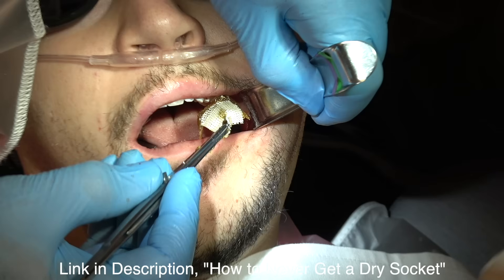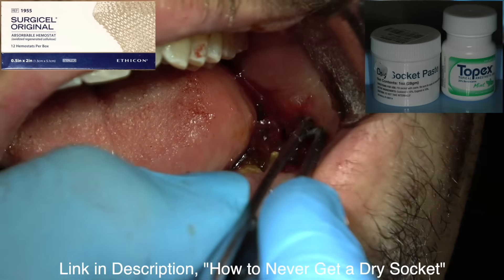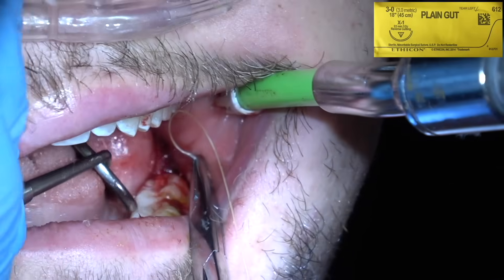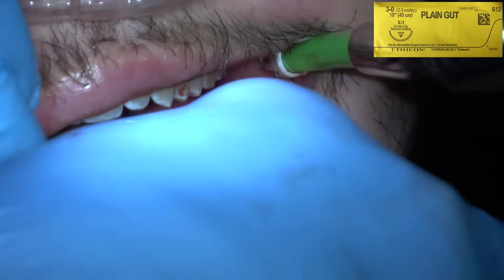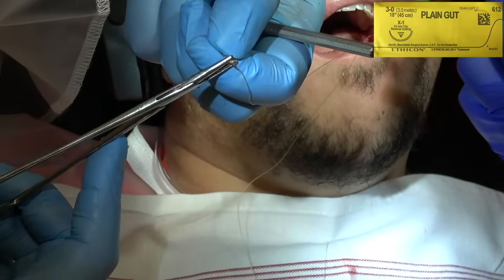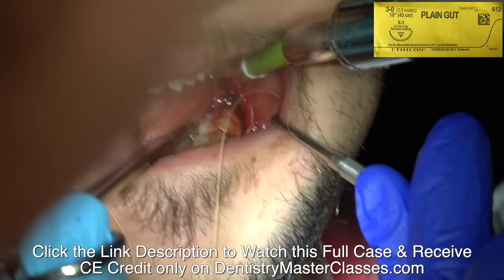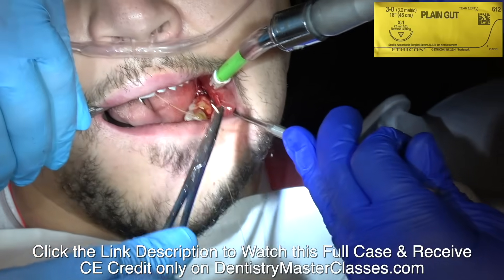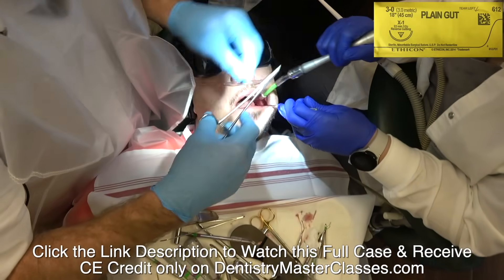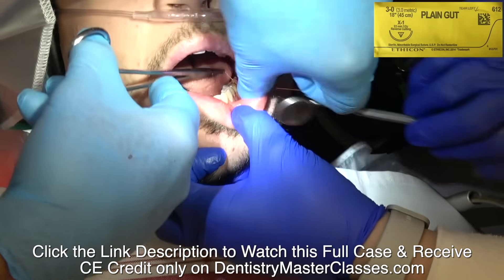I've never had a dry socket in 40 years because I pack the mandibular impacted wisdom teeth with this paste and surgical gauze every time at the time of surgery. It creates a matrix to hold the clot in there — that's what a dry socket is. When you lose the clot, the nerve endings in the bone are exposed. So if you maintain the blood clot with the resorbable gauze and the medicated paste, they won't lose the clot. I'm going to put two or three stitches since I've reflected a pretty large flap. You want to suture that tight. This is 3-0 plain gut suture, and it'll dissolve in four to seven days. You can use chromic gut and it'll dissolve in two weeks, but the ends poke out and irritate the patient's tongue. Four to seven days is fine for a surgery like this.